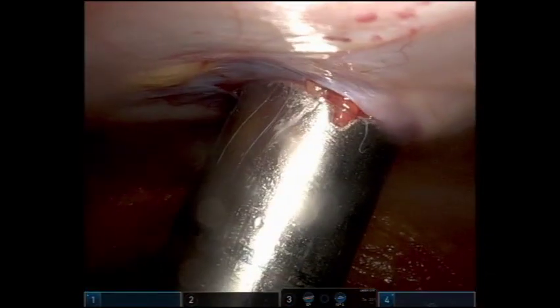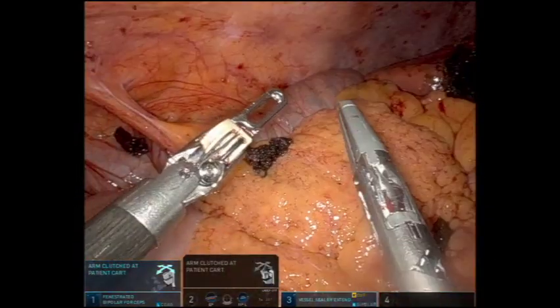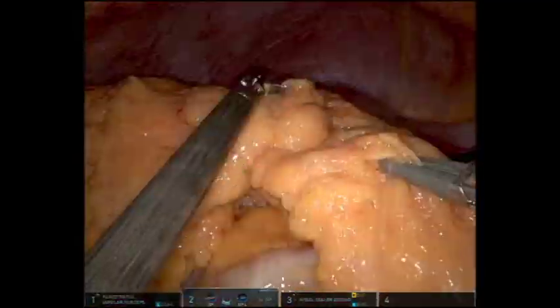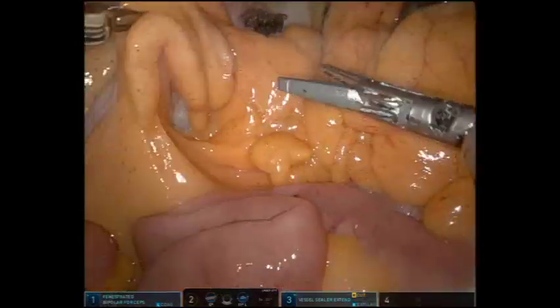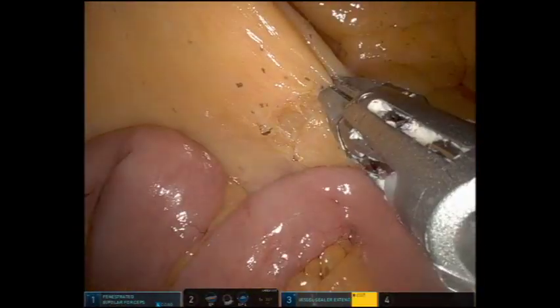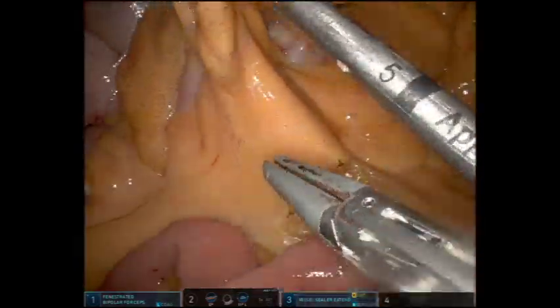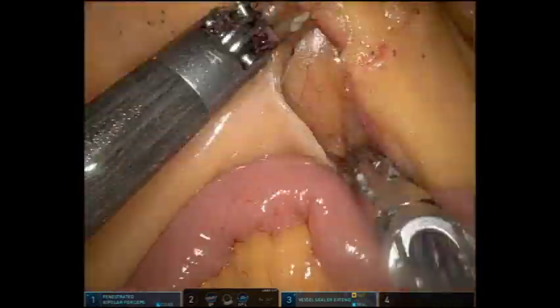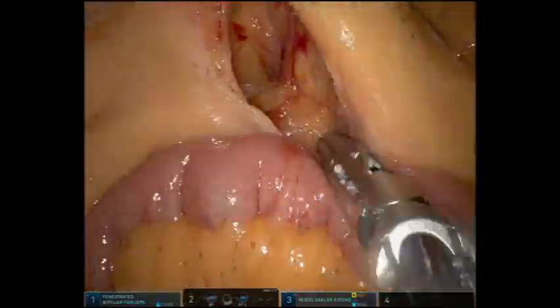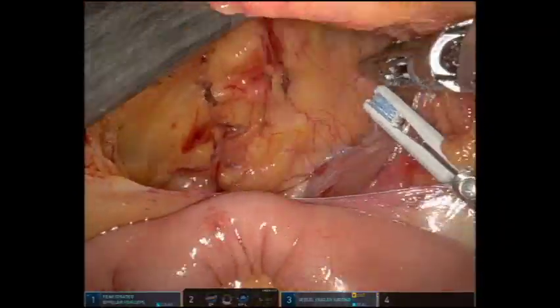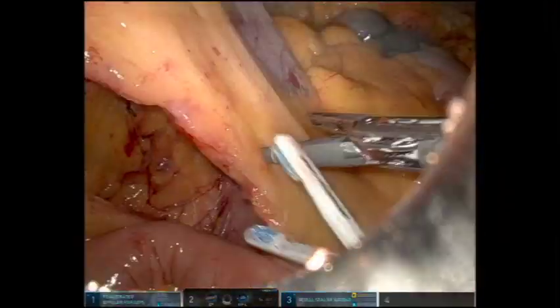A 12-millimeter port was placed into the left flank. The omentum was placed into the upper abdomen to bring the transverse colon into view and the ileocolic axis is placed on stretch. The peritoneum at the base of the ileocolic vessels is opened and a medial-to-lateral dissection is performed, bringing the duodenum into view. The duodenum is fully mobilized so that a high ligation can be performed.